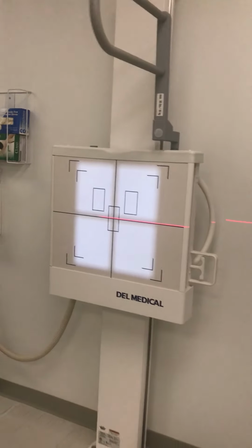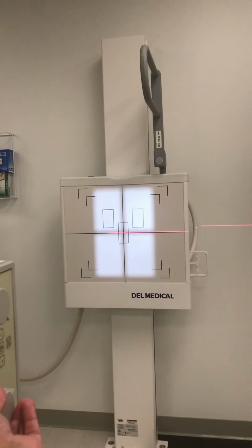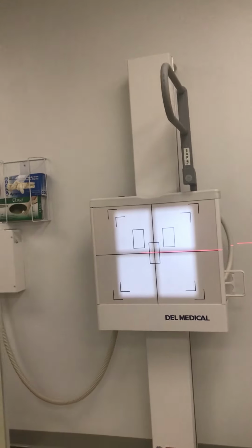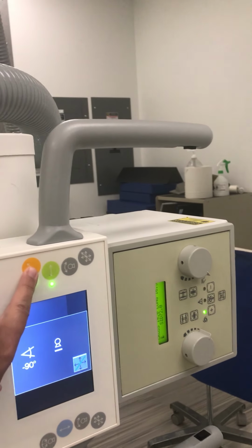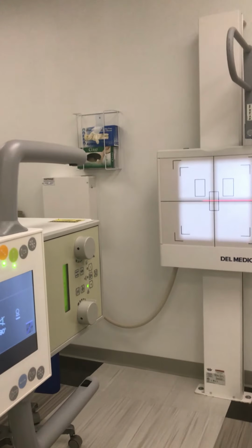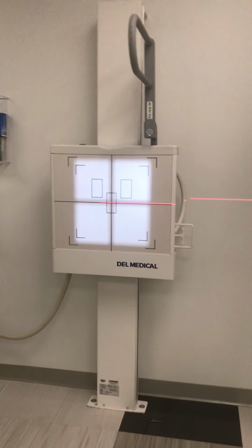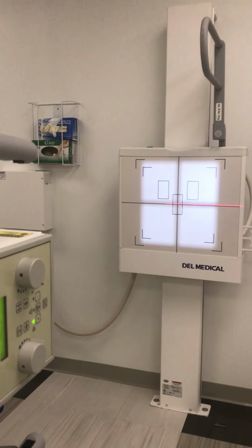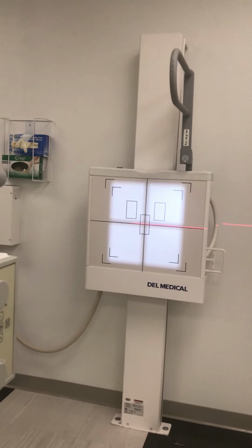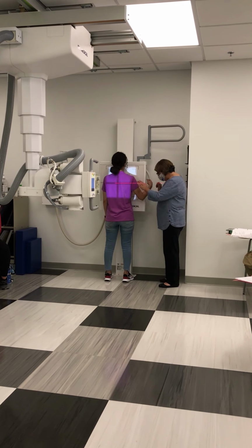And that collimation size will stay that size until I either manually collimate, or if I move the tube out of detent, either transversely or longitudinally for my SID, once I put the tube back into detent, that collimation size will expand again, will default to the 17 by 17 inch size, and I would need to go to the control panel again to correct that and go back to the 14 inch by 17 inch lengthwise collimation size.